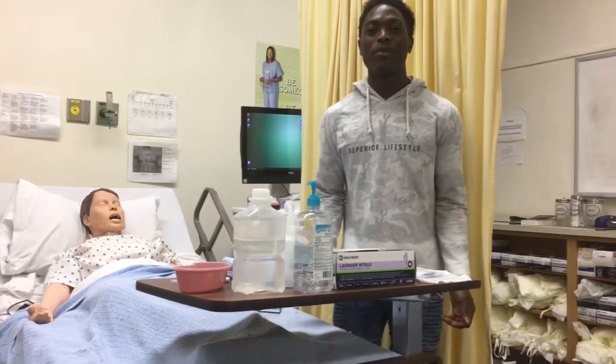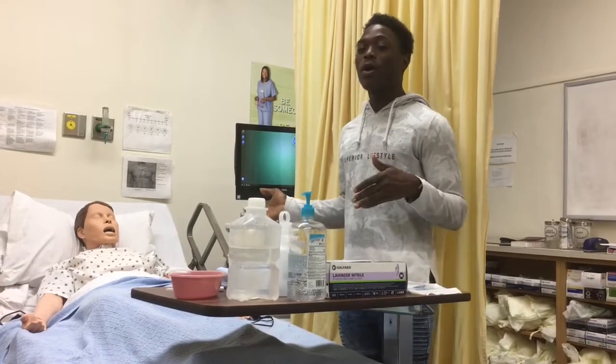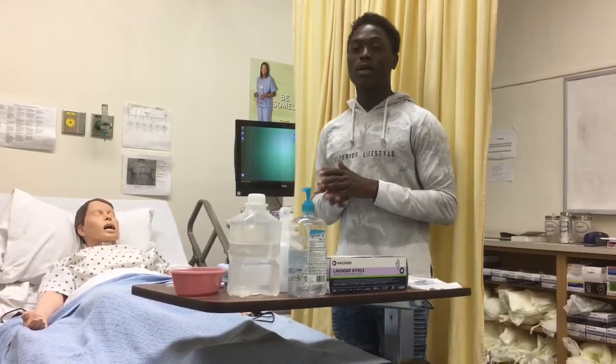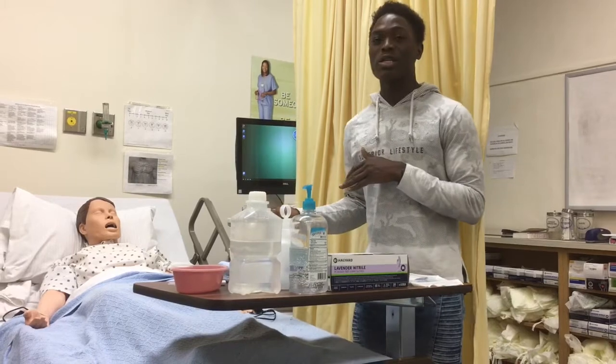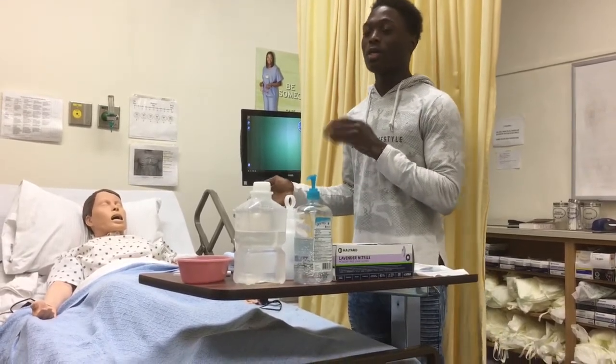Hi, how are you? I'm Prince, and today I'm going to be demonstrating how to perform NG tubing. So my patient is 65 years old, Miss James, and her doctor ordered her NG tube.